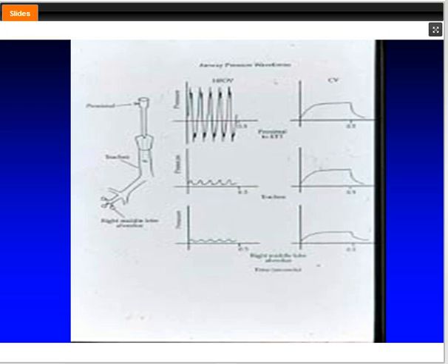At the bottom of the endotracheal tube, it has become more sinusoidal, and it is markedly dampened. When you get out to the alveolar surface, it is a very tiny pressure change, yet this animal is being appropriately ventilated.